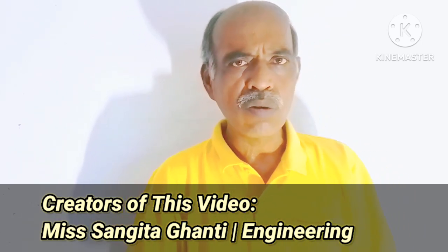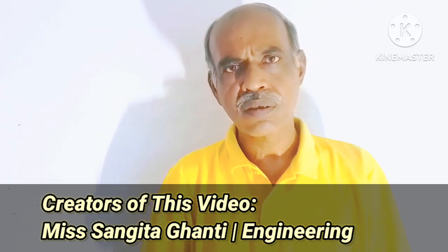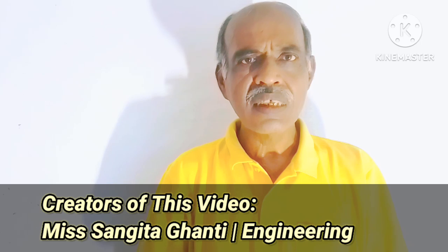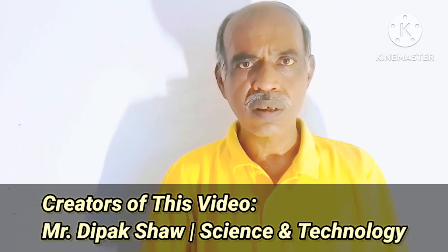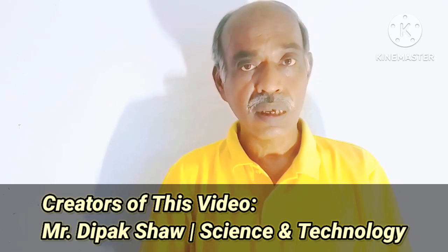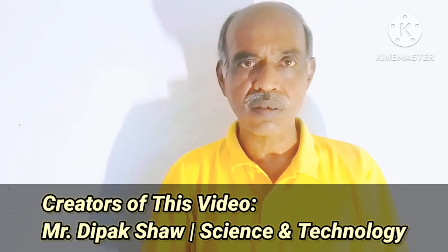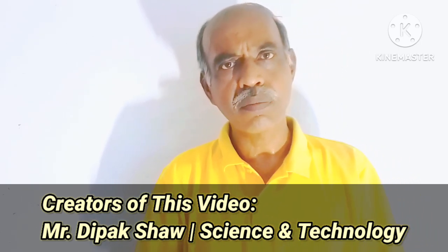But to diagnose diseases accurately, to see the functions, how they function in your body, if that is the requirement of the doctors, then in such cases 4D MRI can be used.